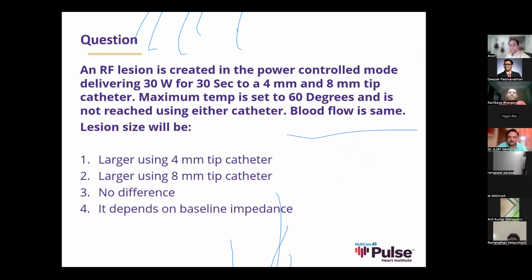I don't know if it's still very low with one grounding patch. I think we can go for a smaller grounding patch, and that will increase the impedance. But I'm not entirely sure if that's being done in pediatric age groups. We've never had a problem with the ablation, even though the typical impedance range we get is in the 80s.